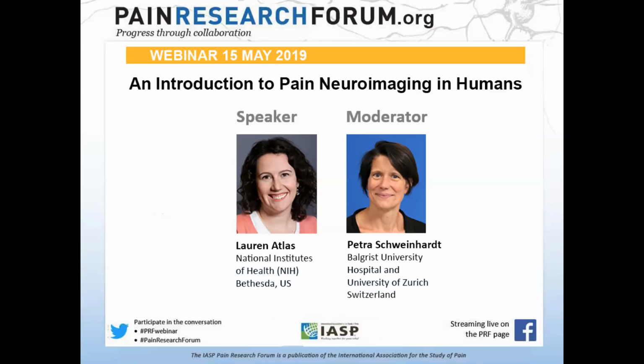Maybe I just take that as an opportunity to point out, because that's something I hear often being wrongly assumed, that if you see an effect of, let's say, an analgesic in a brain fMRI scan, it ought to be a brain effect. And of course, it's very important to keep in mind that it could be an effect anywhere along the neuraxis, right? So let's say we give a nerve block using a local anesthetic, hence there will be less afferent input into the brain. Of course, that would be reflected in the fMRI scan of the brain, but it does not mean that the nerve block was actually effective in the brain.